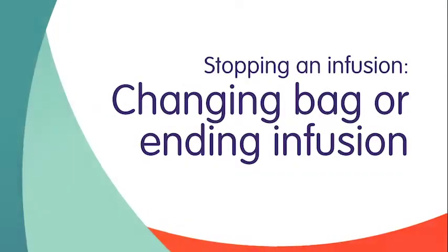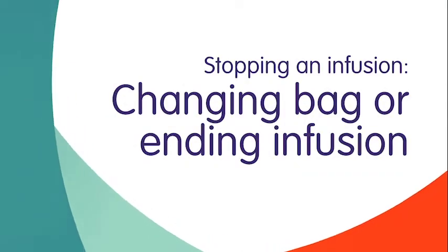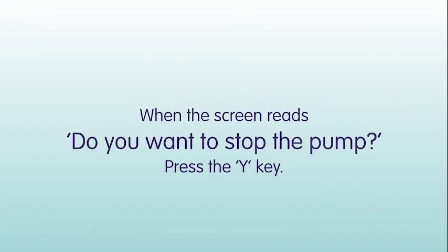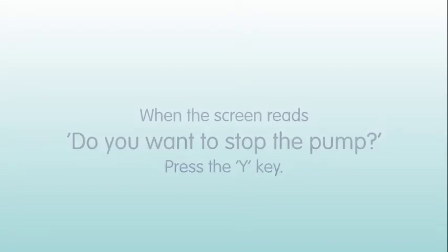When it is time to change the bag or you have been instructed to stop your infusion, stop the pump by pressing the Start-Stop key. When the screen reads 'Do you want to stop the pump?', press the Y key.